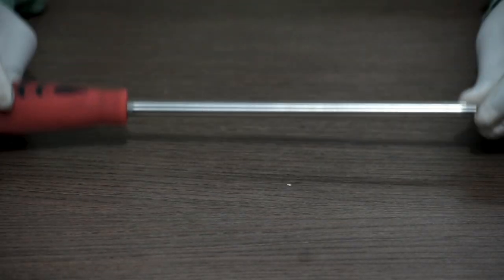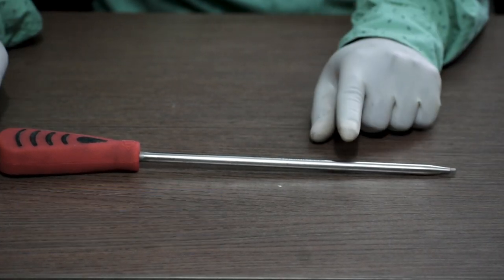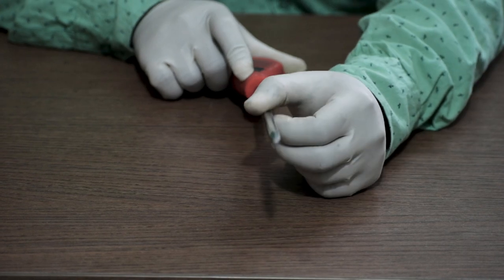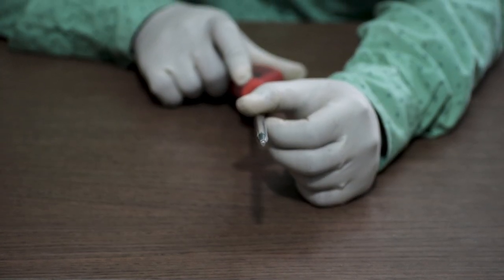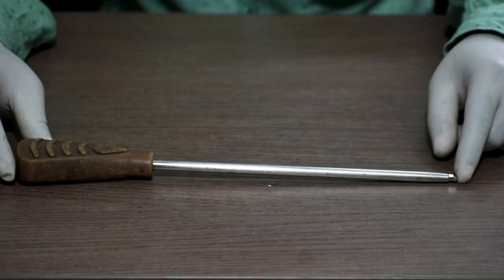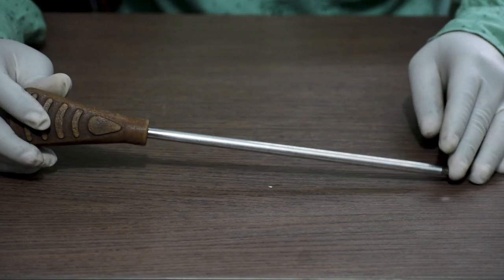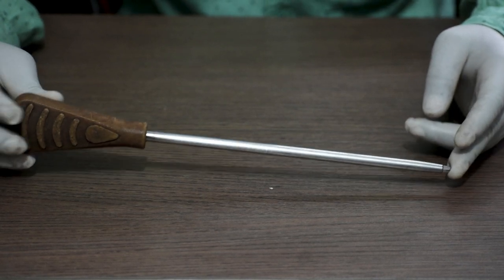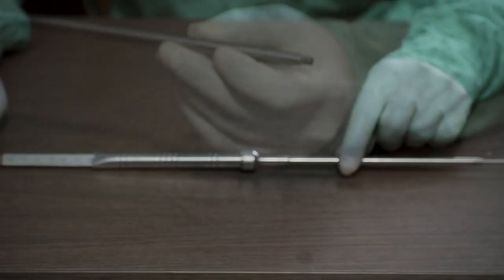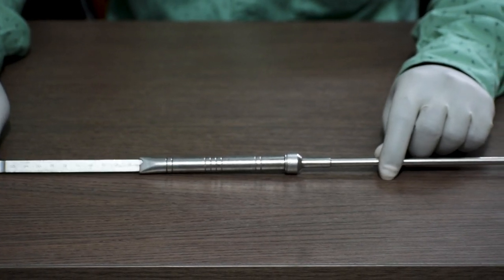Now let us talk about screwdrivers. This one is a 4.5 mm distal locking screwdriver — a solid screwdriver of 250 mm length. This one is a 5 mm locking screwdriver, also 250 mm in length and cannulated. Next is the depth gauge — a long depth gauge generally used for nailing systems.